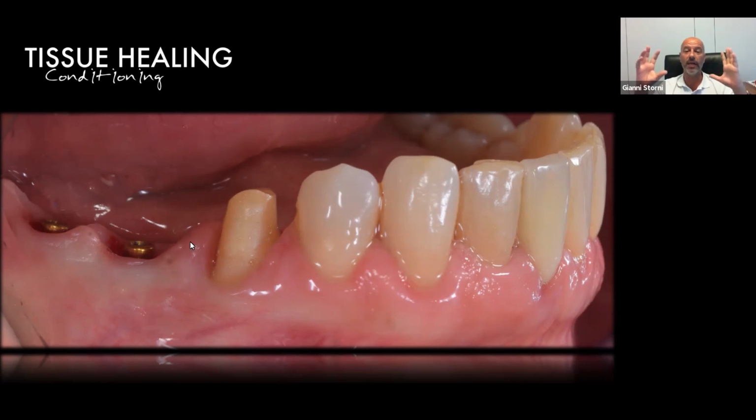You really are able to simplify a lot the procedure and the prosthetic option, same as for the dentist. You don't need a lot of multi-units, 1 millimeter, 30 degree, 25, 17, 1, 2, 3, 4, 5 different heights. Here you have the Equator in 7 heights if you need it, and nothing else.